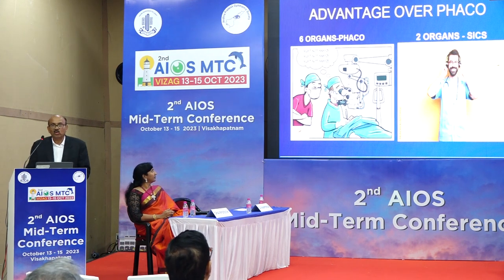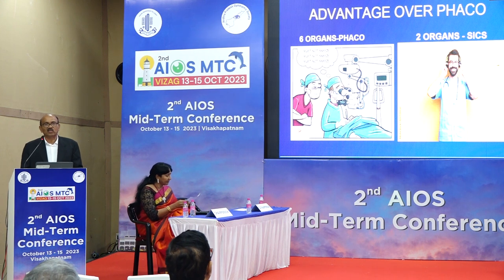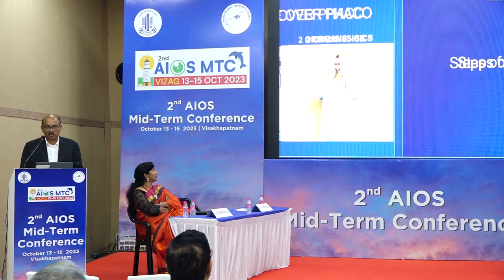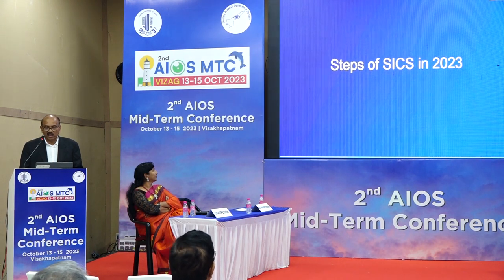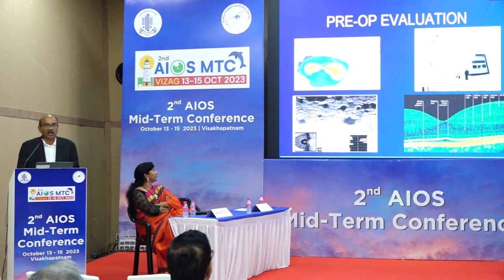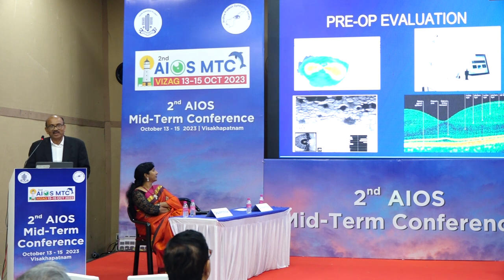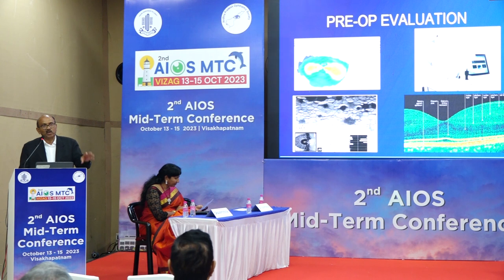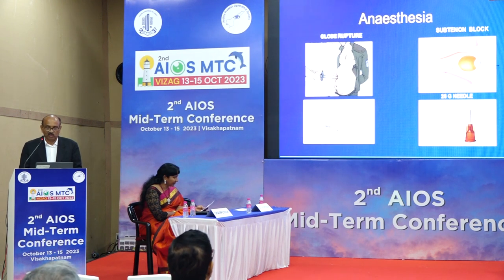For the phaco fellow, you require 6 organs: 2 hands, 2 legs, and 2 ears to hear the sound. Whereas the SICS fellow can close the ears, hear the music and do the job. The steps for modern SICS are: you require a preoperative topographer for the front of the cornea, endothelium imaging for the back of the cornea, OCT for the back of the eye, and a good biometer. With this, you can promise the patient 6-6 or 6-5 vision.